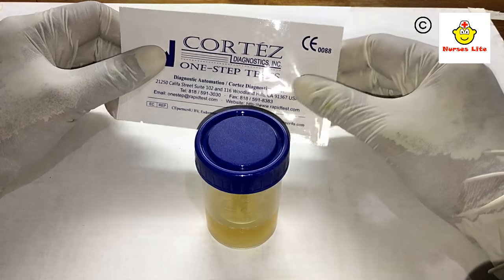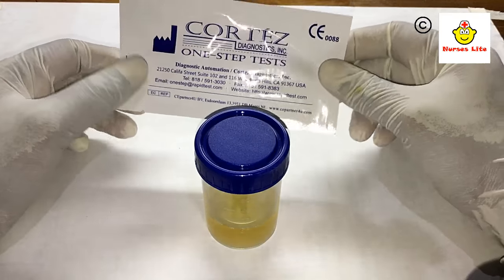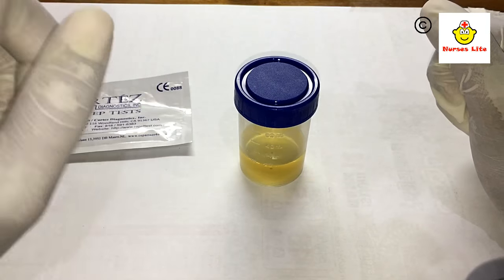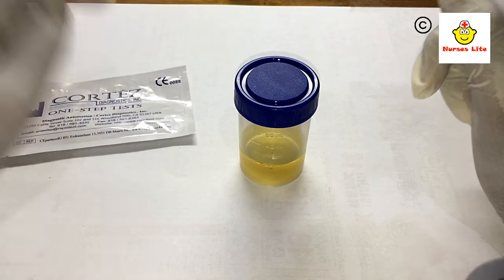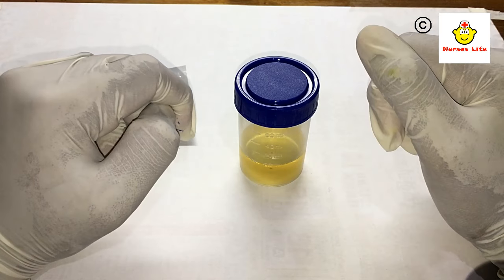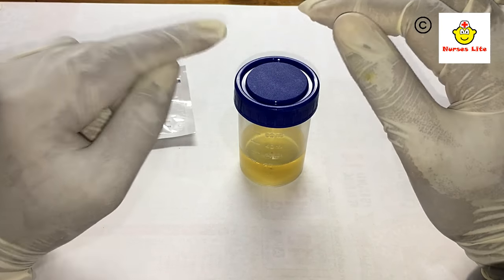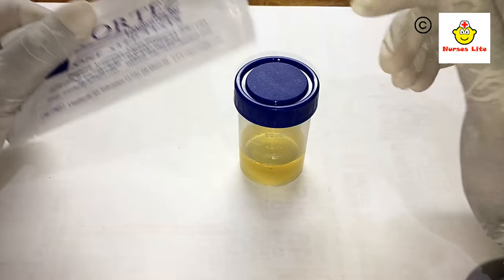After the first absence of the menstrual period, I will now explain about specimen collection. This urine sample is very important for the result of this test. We should collect the first morning urine sample, as HCG is more concentrated in this sample, which ensures correct results.